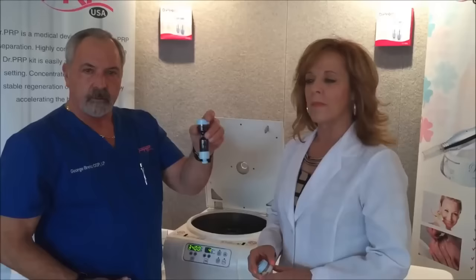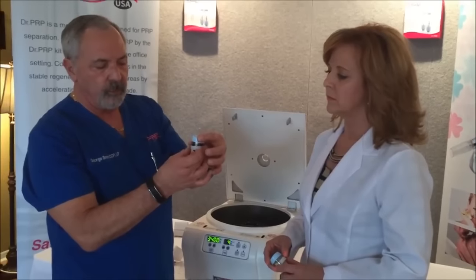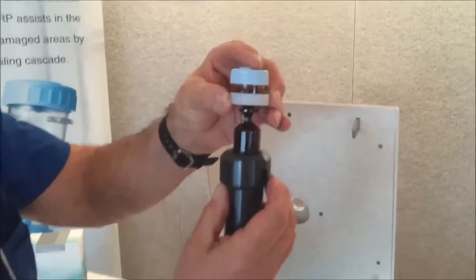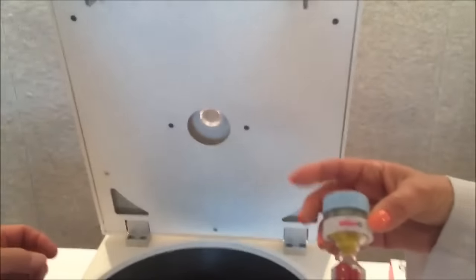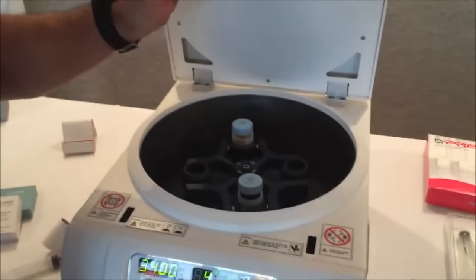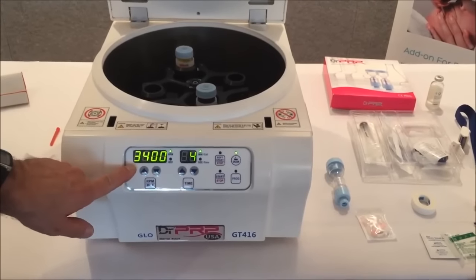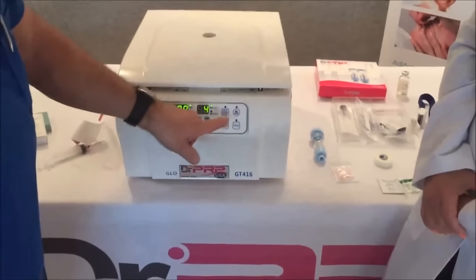Now that we have our blood in the kit, each centrifuge comes with rings. We're going to insert the ring through the kit — it rests on these two shoulder ledges on each kit — and then set it down inside one of these buckets, which rests on the rockers on the rotors. Then you're going to do the exact same thing with your counterweight into the opposite carrier of the centrifuge. Now that we have them resting in the centrifuge, we're going to do a spin at four minutes at 3,400 RPM — not RCF — and hit start.